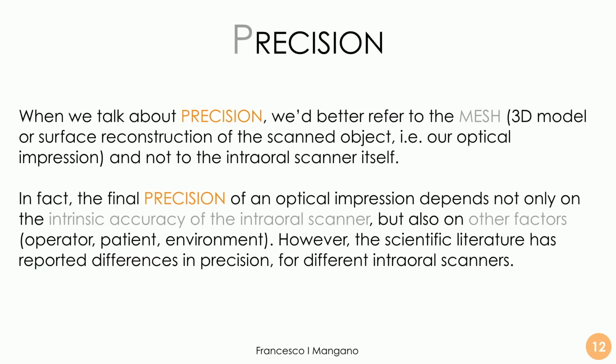So it's also important to say that when we talk about precision, we better refer to the mesh itself and not to the intraoral scanner itself, even if the intraoral scanner is a factor, because there are scanners that are more precise than other scanners. But anyway, we should refer to the mesh because technically there can be confounding factors, other factors that can generate an error in precision and they can give a higher standard deviation.